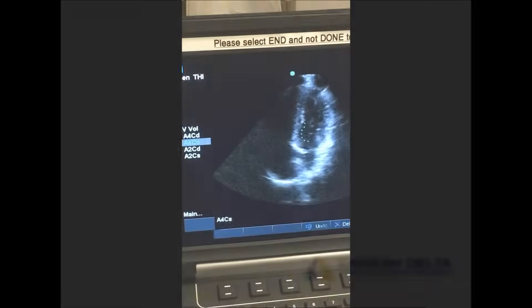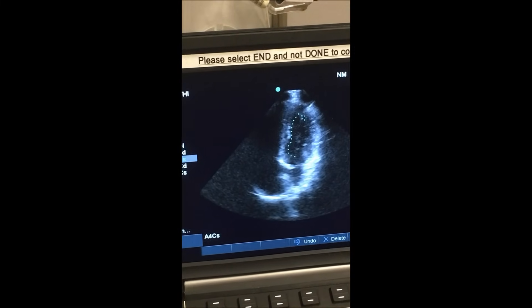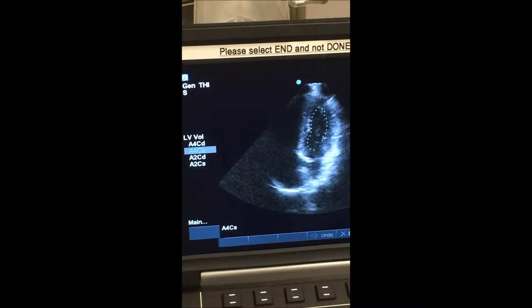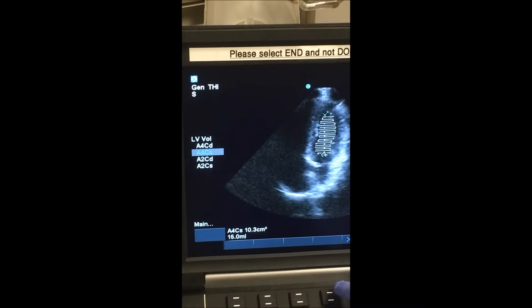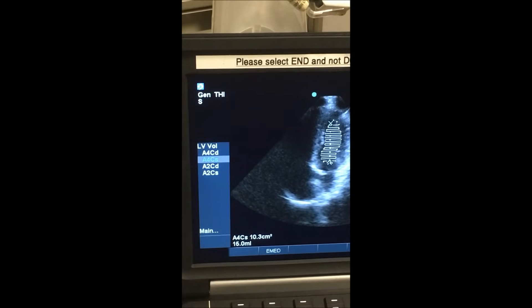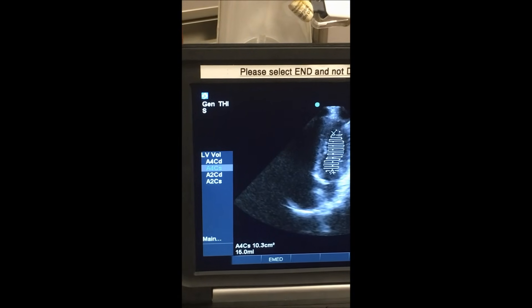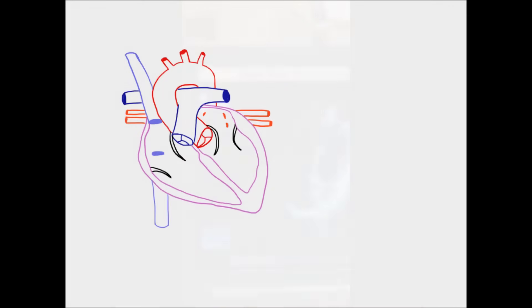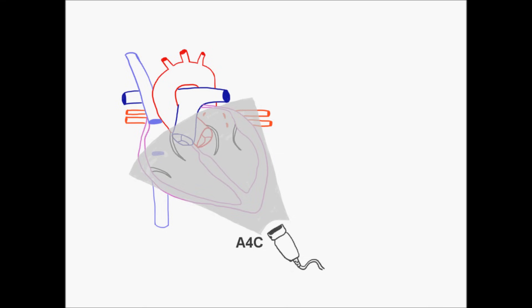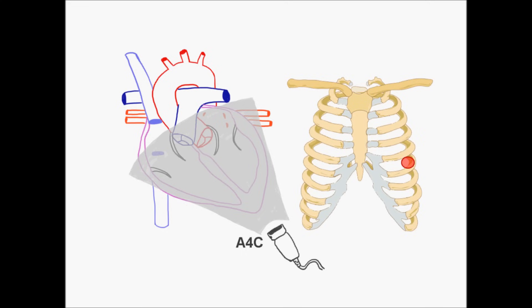By tracing the margins of the left ventricular cavity during end diastole and again during end systole, the machine can detect changes in cavity size — fractional shortening — and calculate an estimated ejection fraction. This is known as the Simpson method. To employ it, we obtain an apical four-chamber view using a phased array probe placed on the anterior axillary line at the apex of the heart, aligning the probe along the short axis of the heart running between the right hip and the left shoulder, placing the indicator on the same side as the screen marker, and aiming the beam toward the right shoulder.